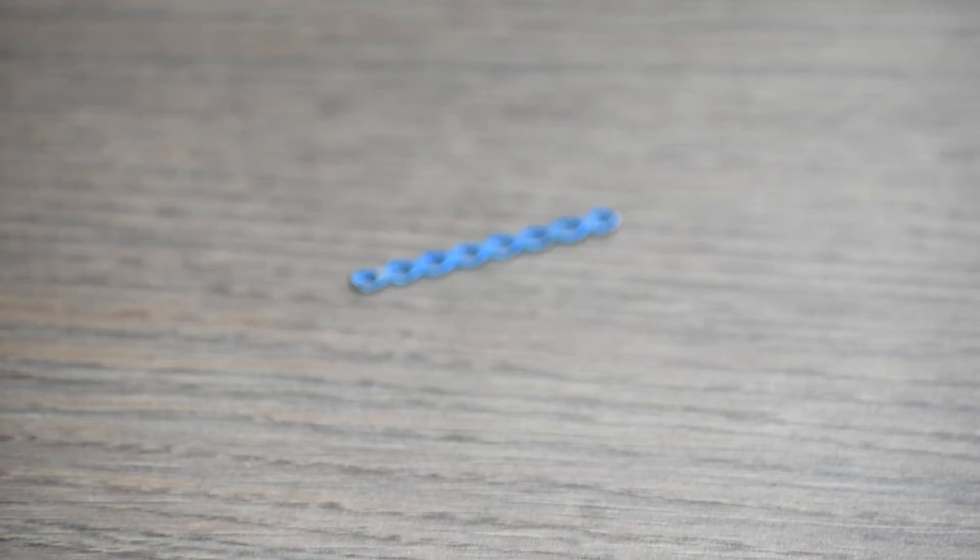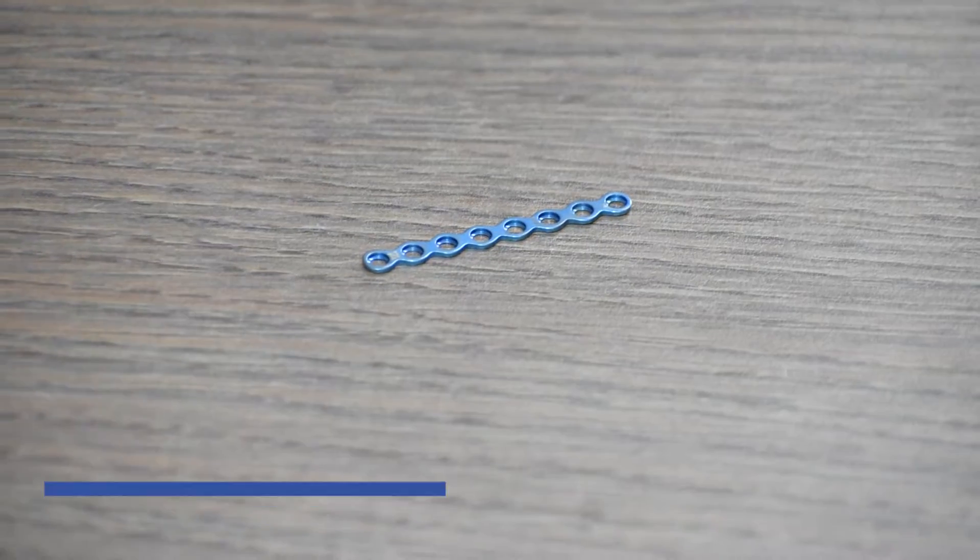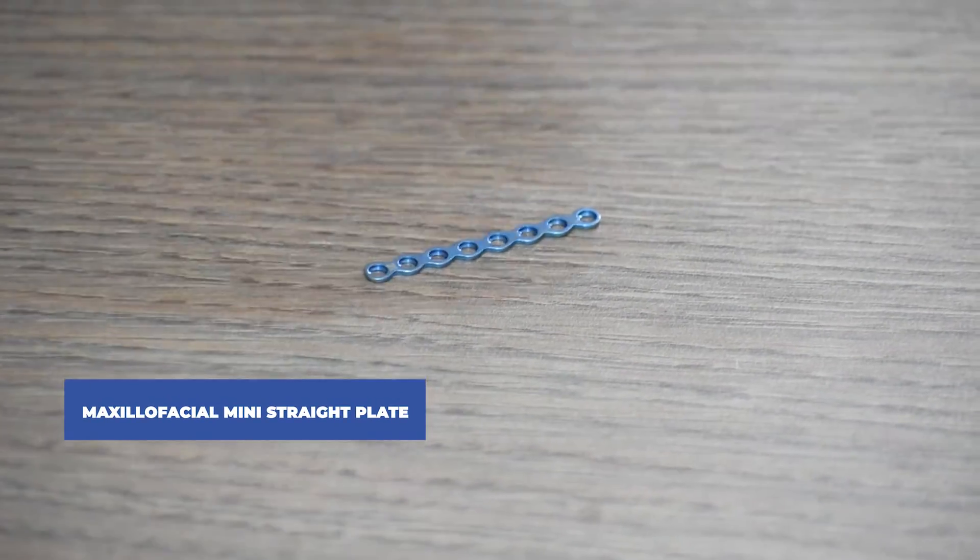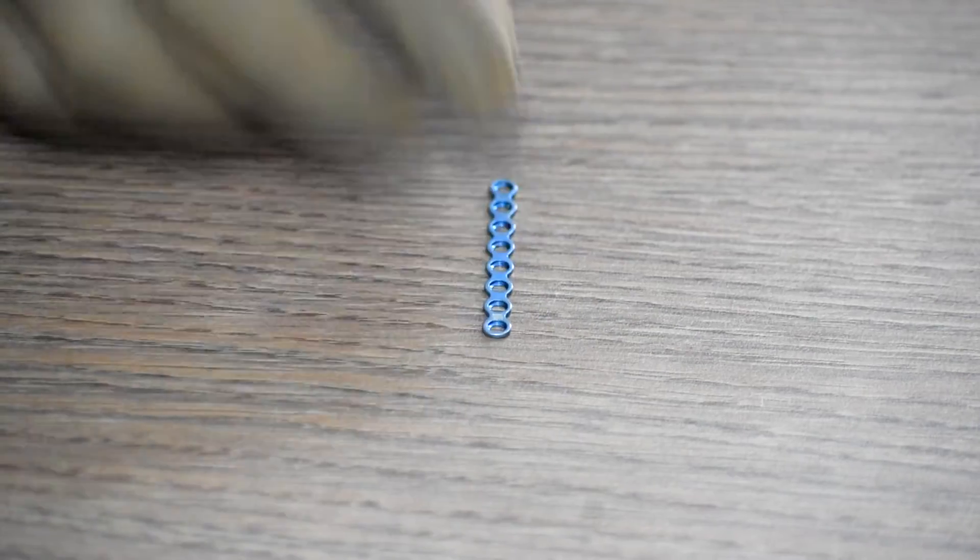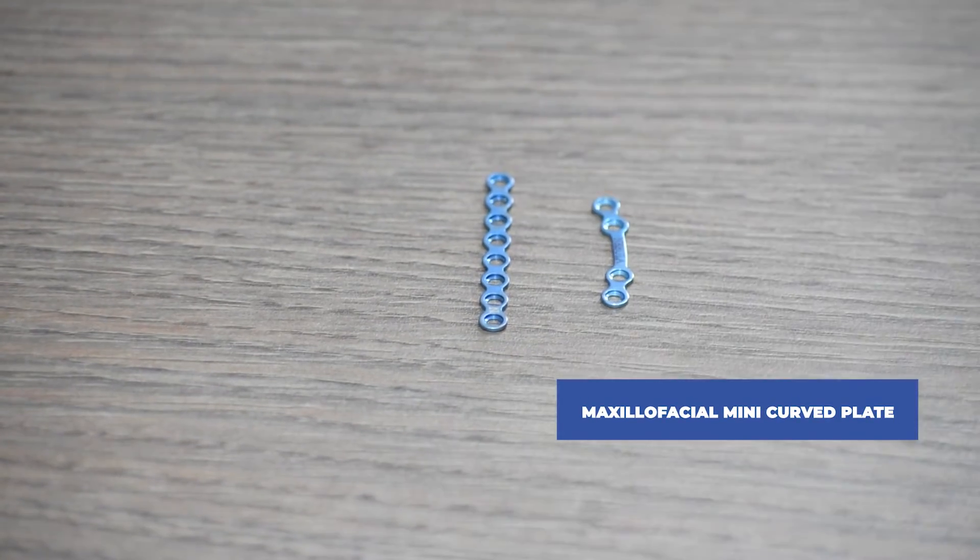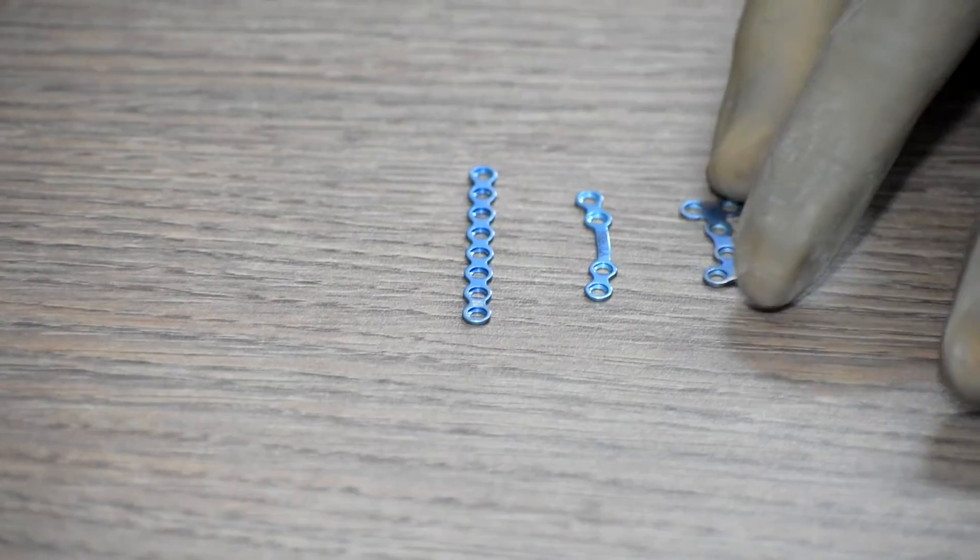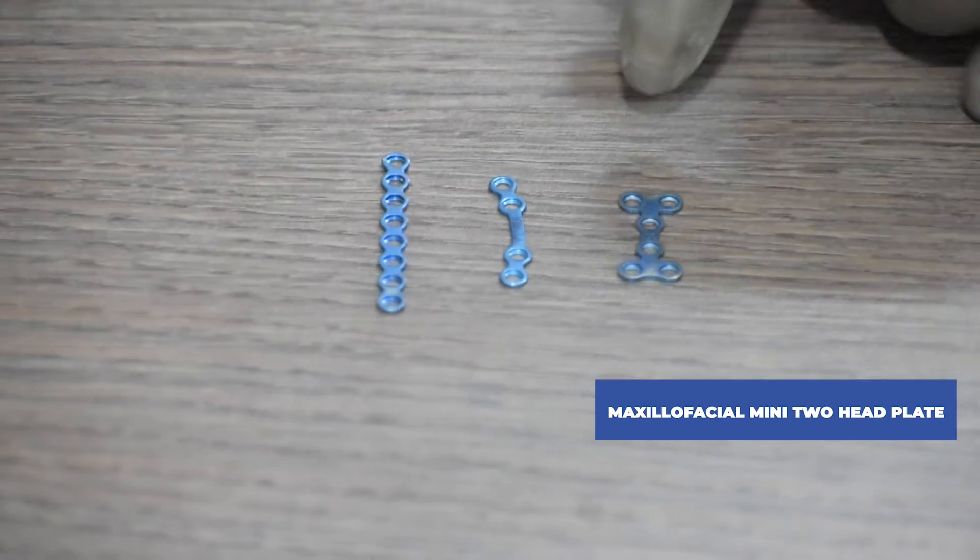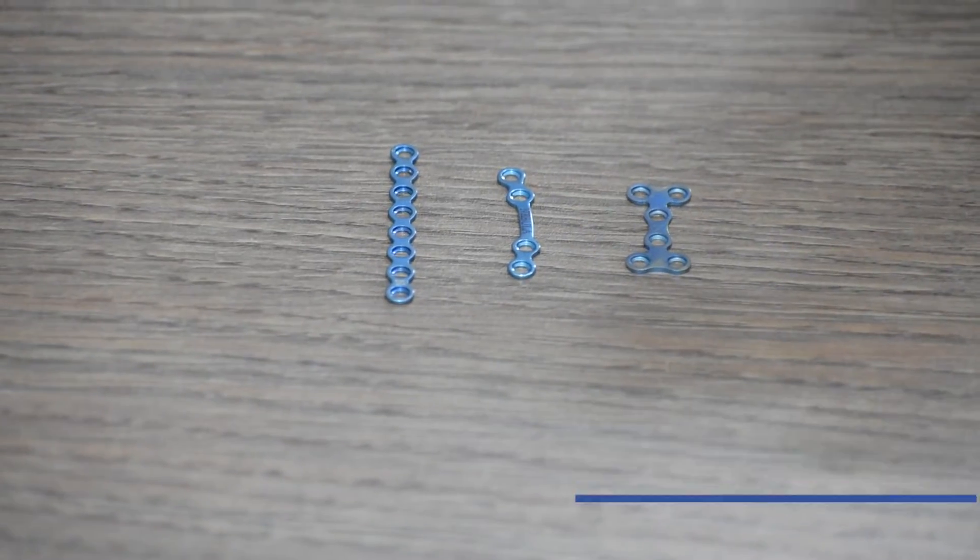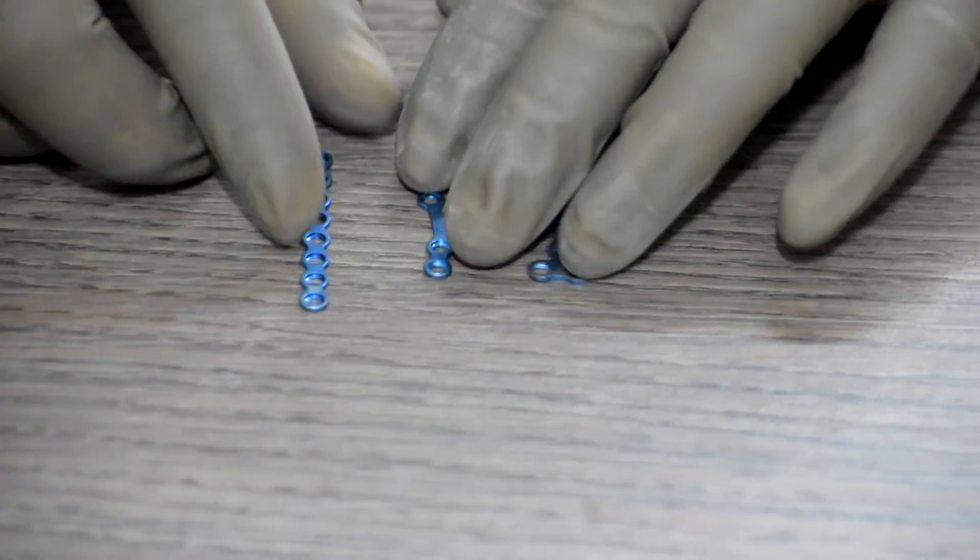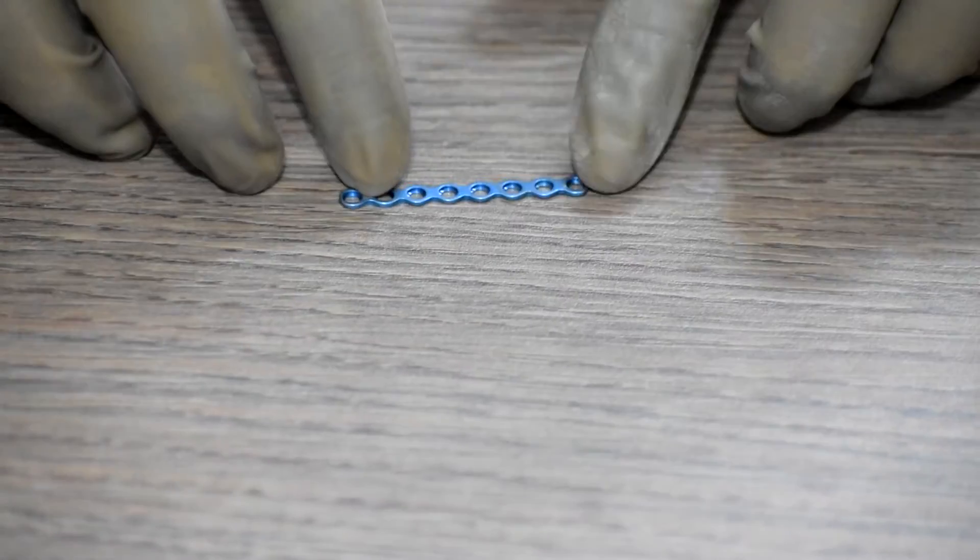As discussed in the previous video, there are three types of maxillofacial mini plates in general: maxillofacial straight mini plate, maxillofacial mini curved plate, and maxillofacial mini two head plate, which is already discussed in the previous video. We will discuss the procedure with the straight plate.